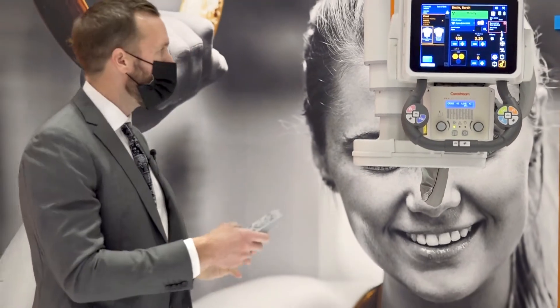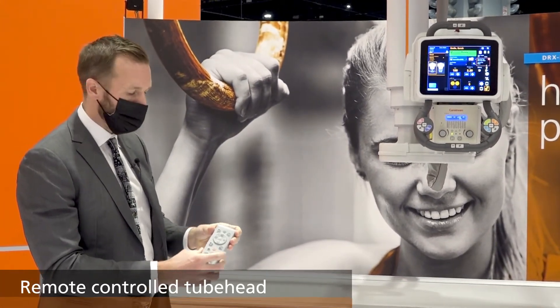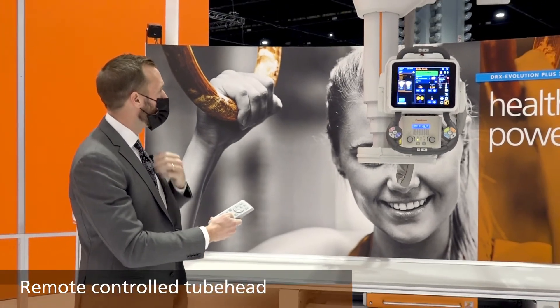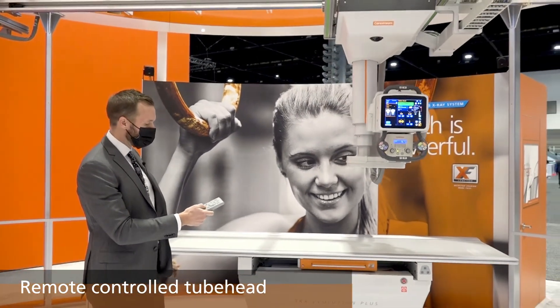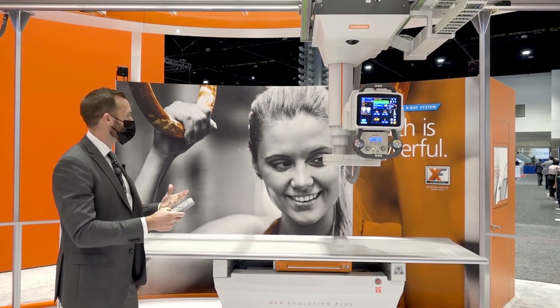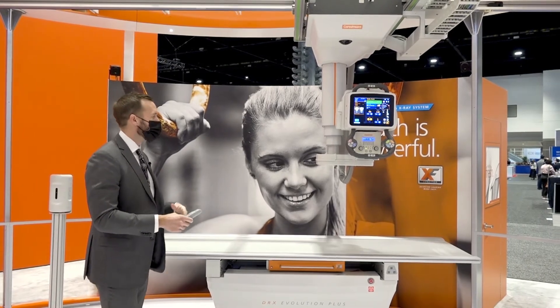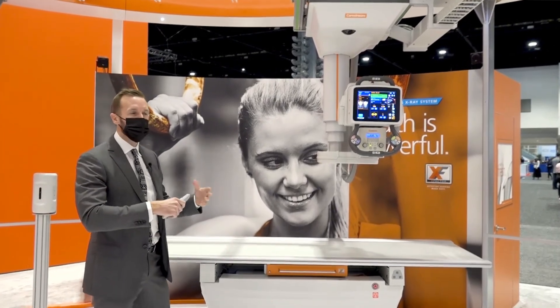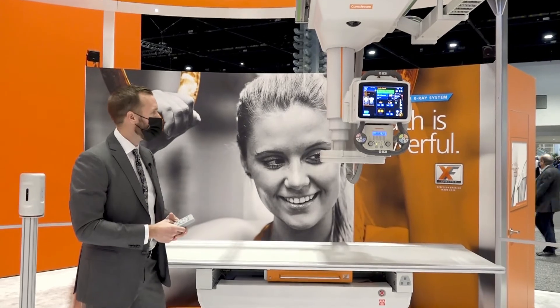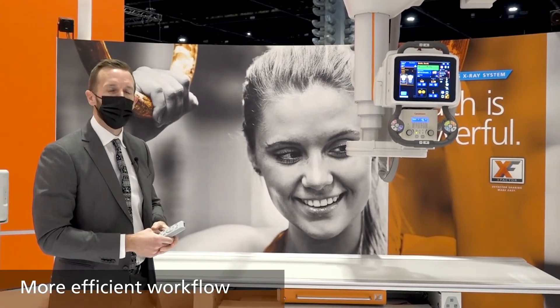The tube head — we now have the ability to control it with our remote as well. So you're able to actually move your tube head along your longitudinal rail and vertically as well. Again, just another option for the technologist to have when they're working in room, in terms of flexibility of moving the machine around the patient, and really focusing on the most efficient exam flow that we can deliver.